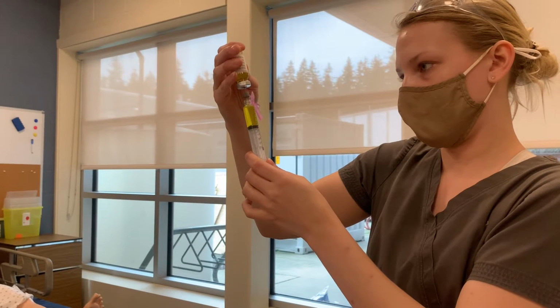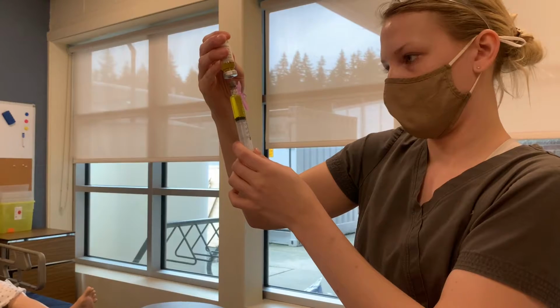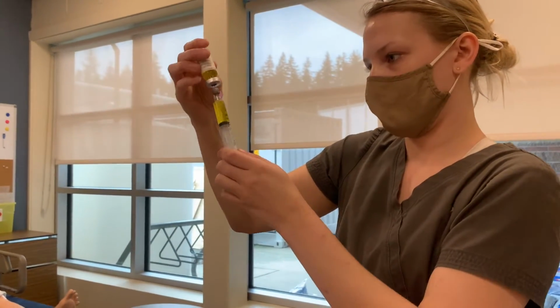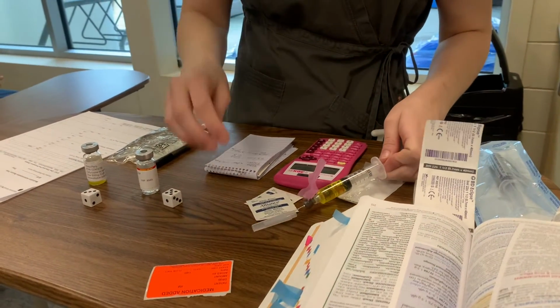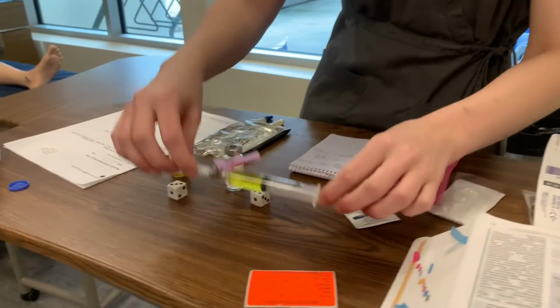And there we go. Perfect. I'm going to go ahead and scoop this. Wonderful. So I have my 5.3 milliliters of solution there.